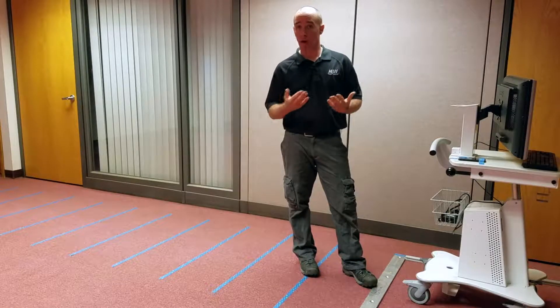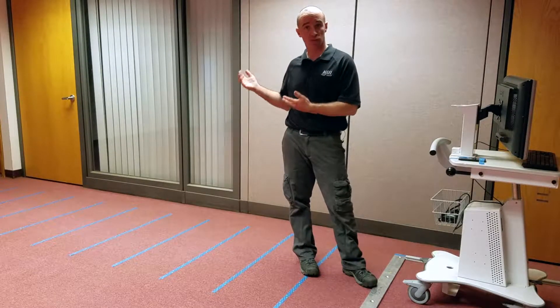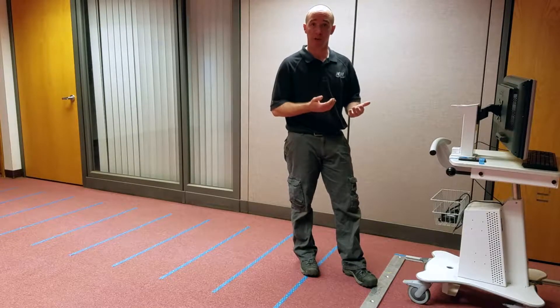The cart successfully went up and over the threshold, did not overbalance, and so we just need to do this nine more times. If we have the same results, the cart passes.